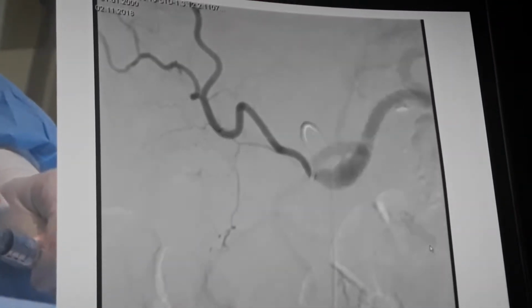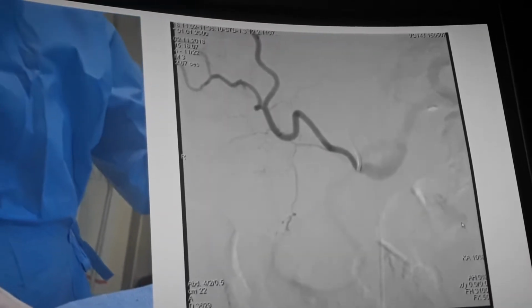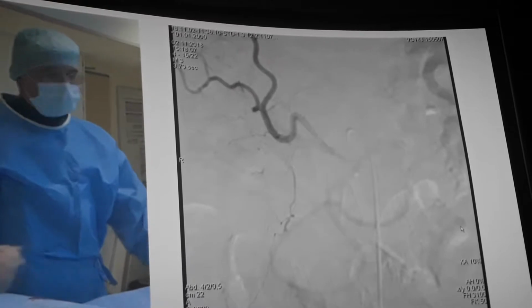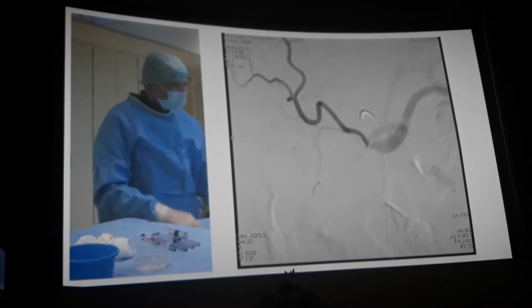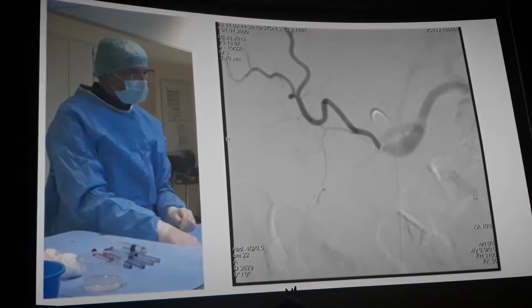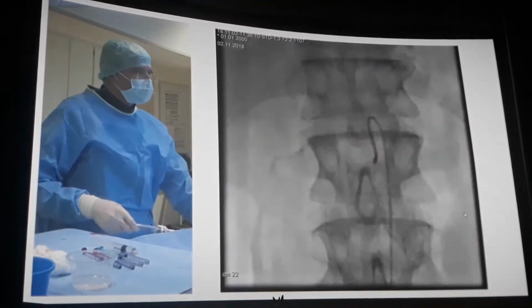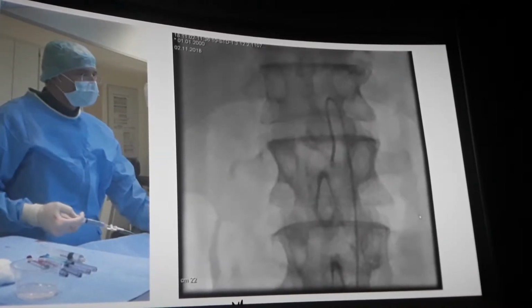Please hold your breath for a moment. And we can go through the images one by one. We've just captured a series. Here you see that the anatomy is quite interesting. I'm moving the catheter close to the celiac trunk, and I'm in a very strong side vessel. It's the inferior phrenic artery. And I have to circumvent it somehow because that's not my target.